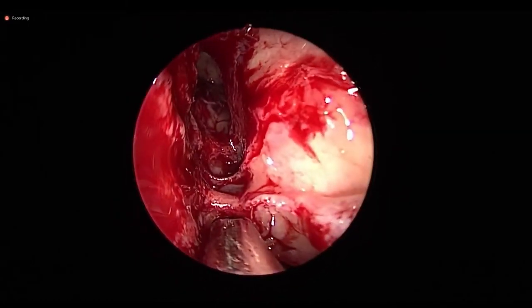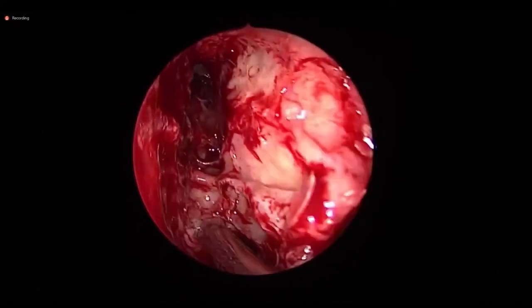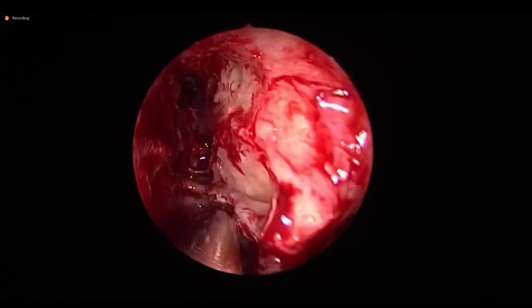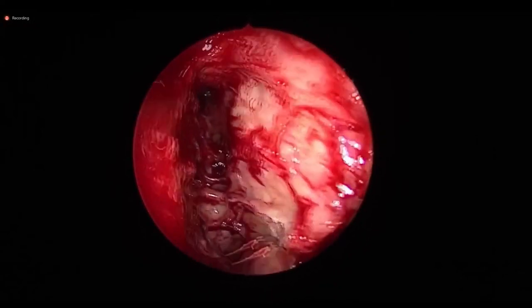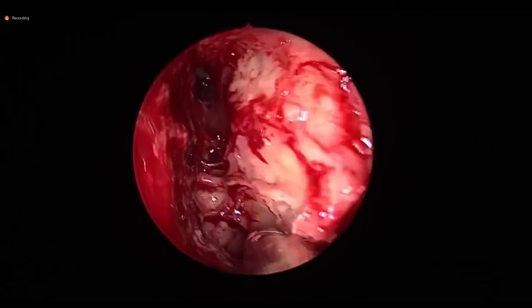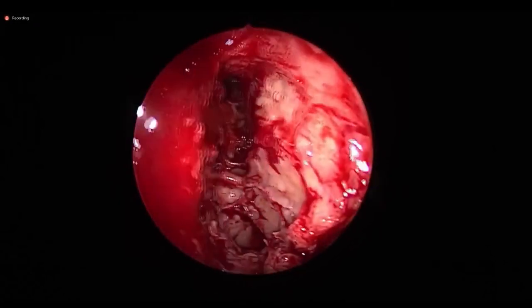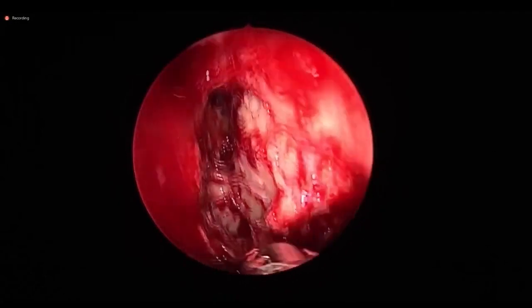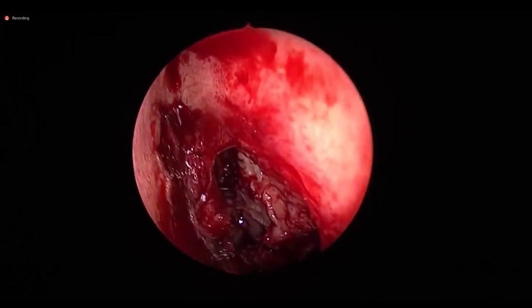Can you see very clearly? Everything has to be mucosal. Now, about counting the cells, the important thing is not to leave any cell unopened. See my limits flushed. Along the lamina, all cells flushed. Along the turbinate, see this?